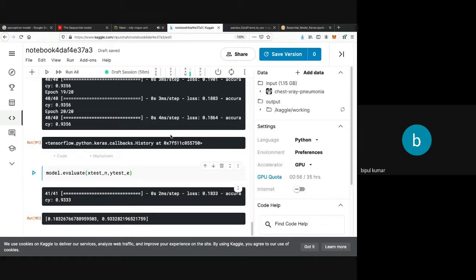That means my model can't be used for any kind of deployment purpose. It is not a successful model. We can't say my training accuracy is 94%, please consider my model. It can't be considered unless on unknown data the model gives a good accuracy.